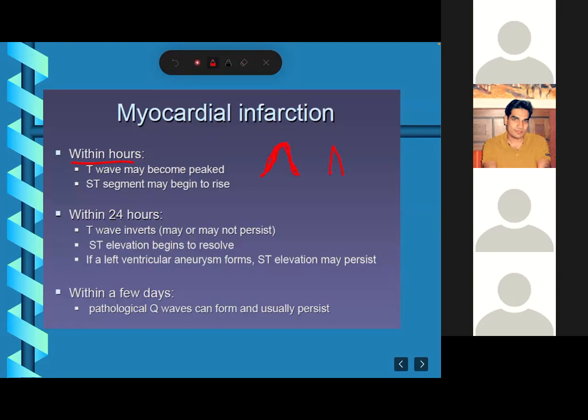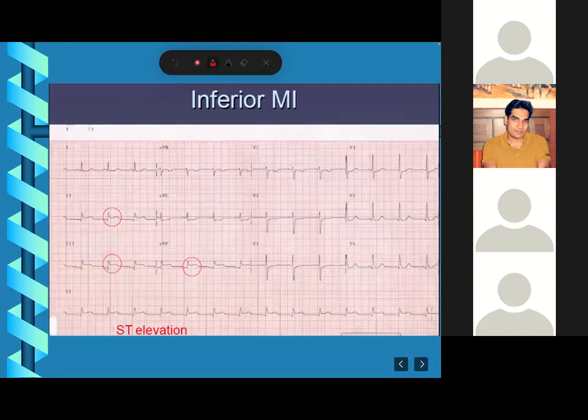Then the ST segment elevation comes to rise. We will see it like this. There is ST segment elevation, elevation of S and T. This is an example of ST segment elevation.